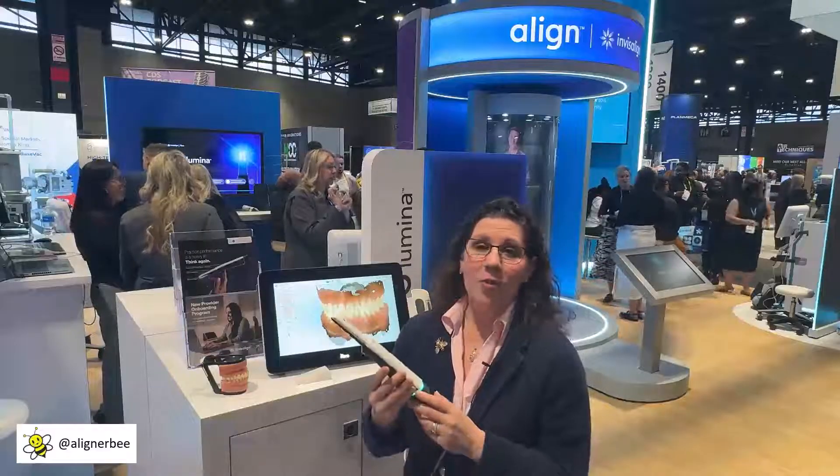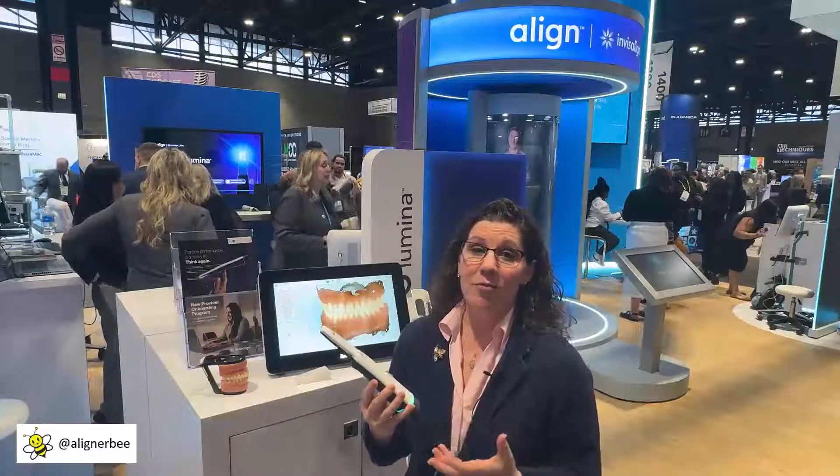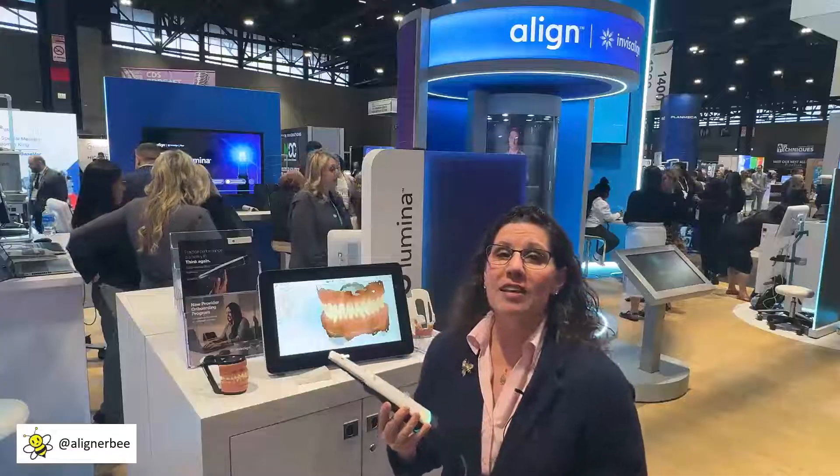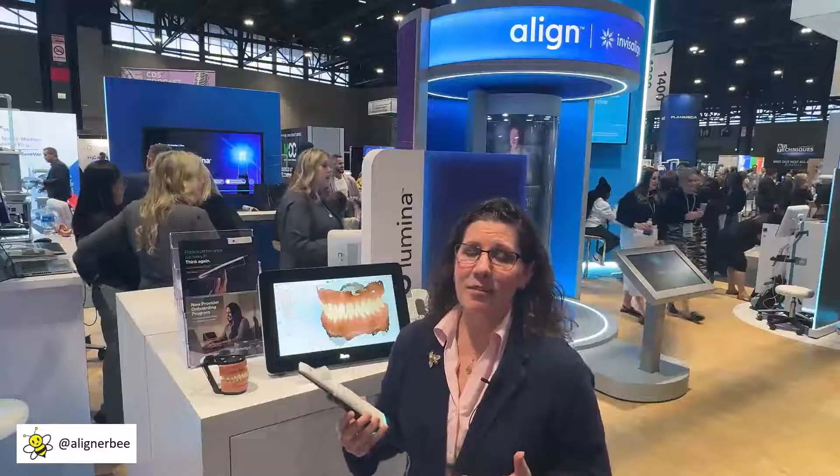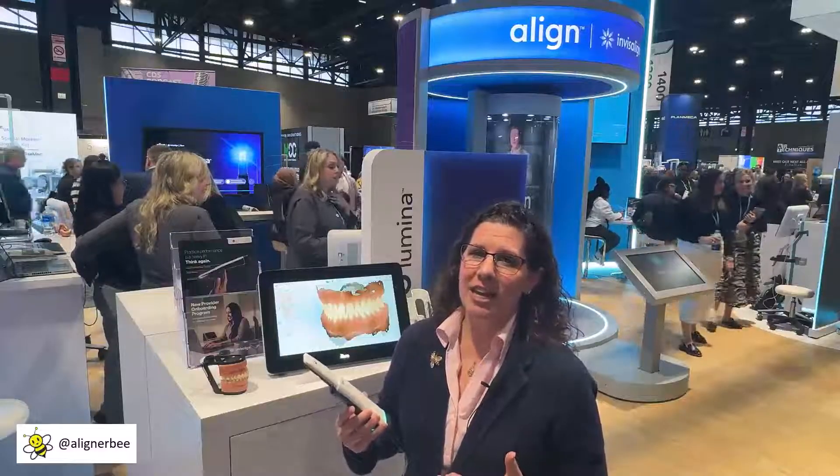The new iTero Lumina is a significant redesign from the previous iTero scanner. Let's go ahead and talk about the positives and the negatives of some of the technology that we're seeing here.